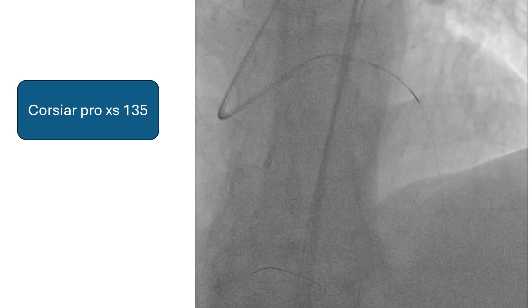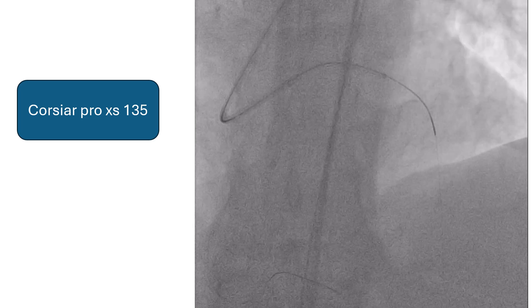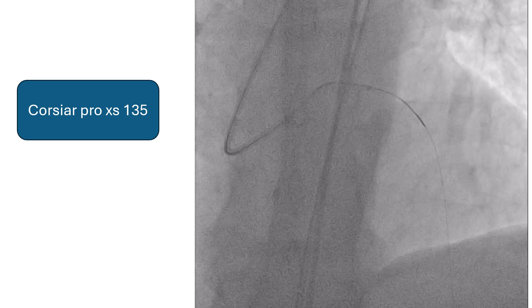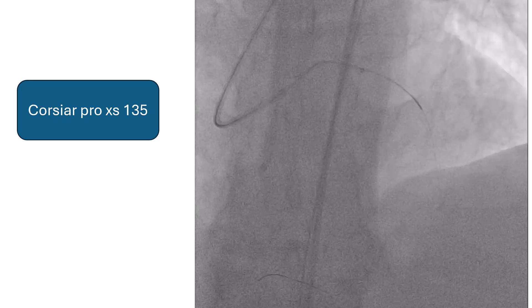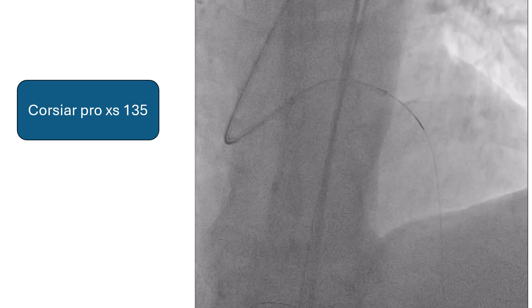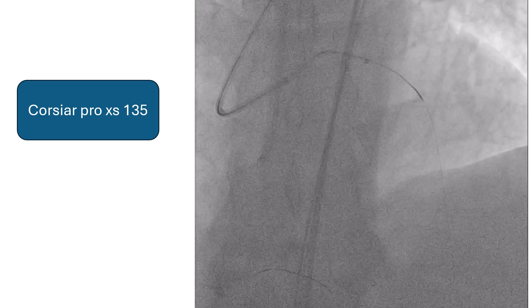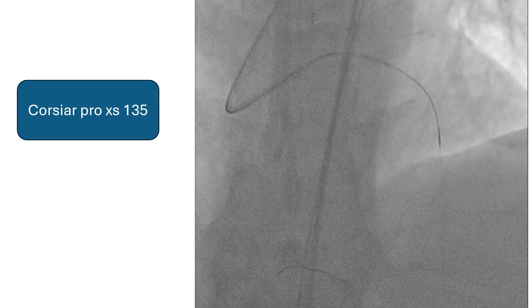We thought that the lesion was not much calcified and that failure of crossability was due to tortuosity inside the lesion. So we used a new Corsair Pro-X 135, and with some manipulation and rotation we were able to cross the lesion. The microcatheter was passed in and out several times to create a track for ballooning.